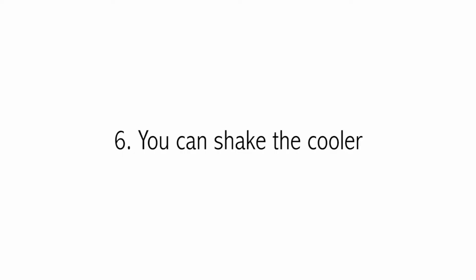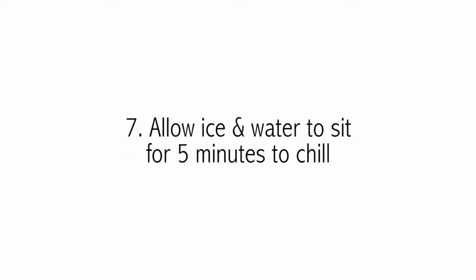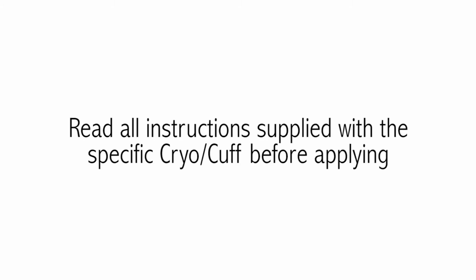6. You can shake the cooler. 7. Allow ice and water to sit for 5 minutes to chill. Always apply the cuff empty. Use only Aircast CryoCuffs with the Aircast CryoCuff IC unit. Read all instructions supplied with the specific CryoCuff before applying.